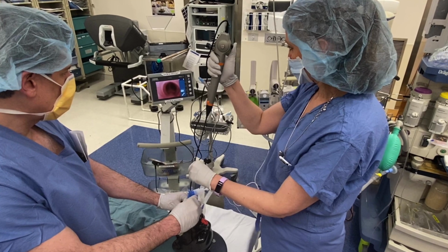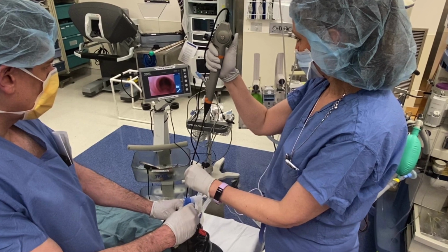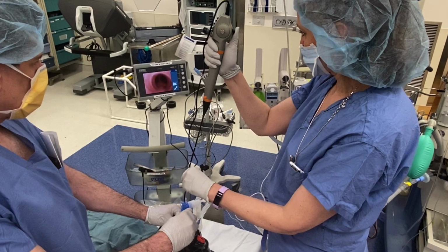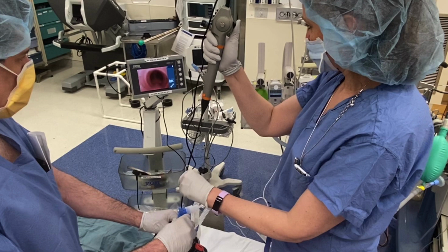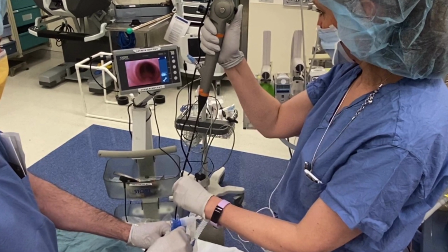If a fiber scope is absolutely not available, then at a minimum, monitoring the end-tidal carbon dioxide level and/or the breath sounds as the tracheal tube is advanced are essential. Without the fiberscope, the success rate will drop dramatically.